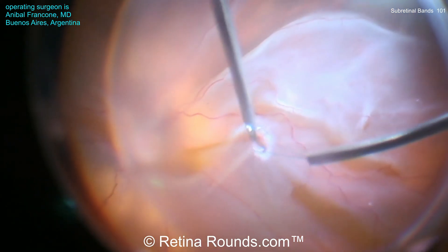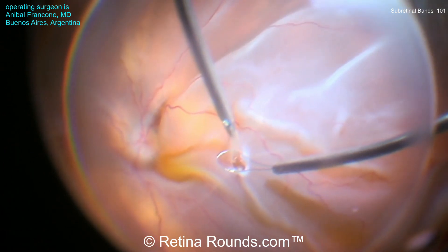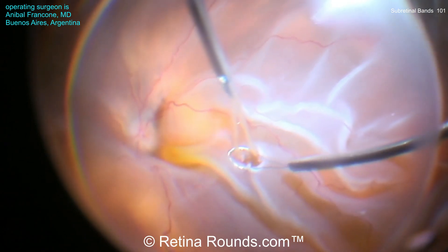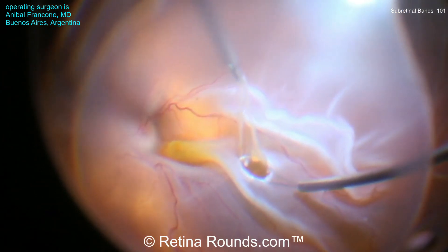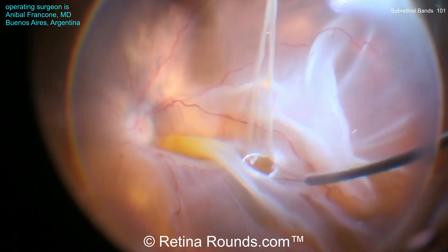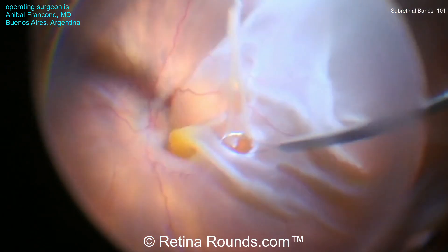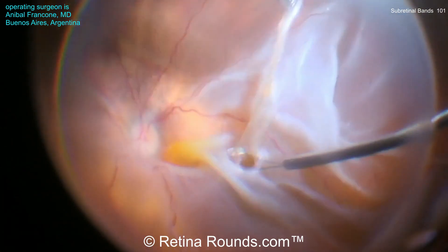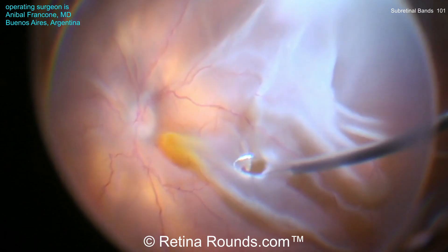Let's have one more look at the napkin loop technique. Diathermy is applied over the subretinal band. The flex loop is positioned over the retinotomy site, and then max grip forceps are used to grasp the subretinal band. As that band is pulled out from the subretinal space, the flex loop holds the retina down to provide countertraction. This helps avoid expanding the retinotomy site, prevents hemorrhage, and decreases the risk of distal retinal break — making this a simple yet elegant modification for performing the procedure with much greater safety.